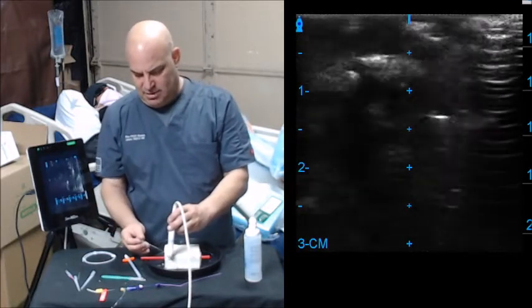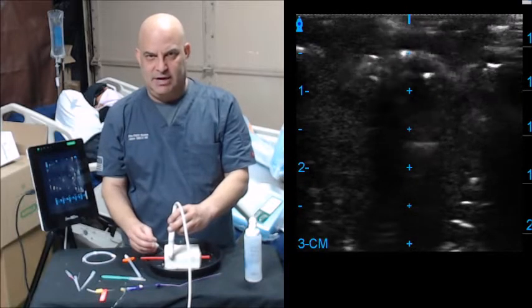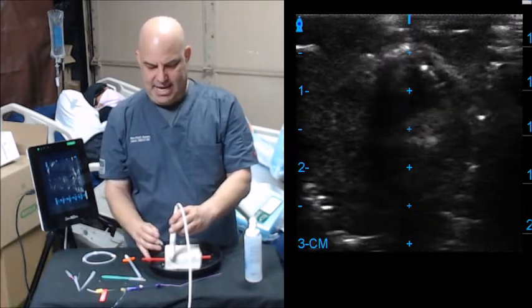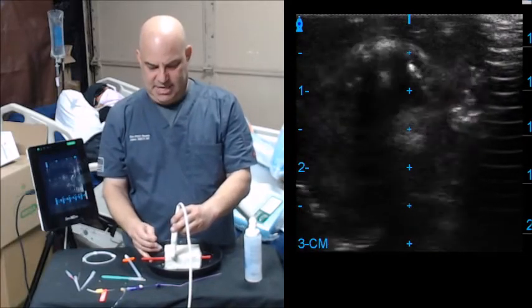See that black circle right there in the middle? I'm passing this shiny little line right there on it. All I have to do is get inside of it, confirm I'm inside the vein.